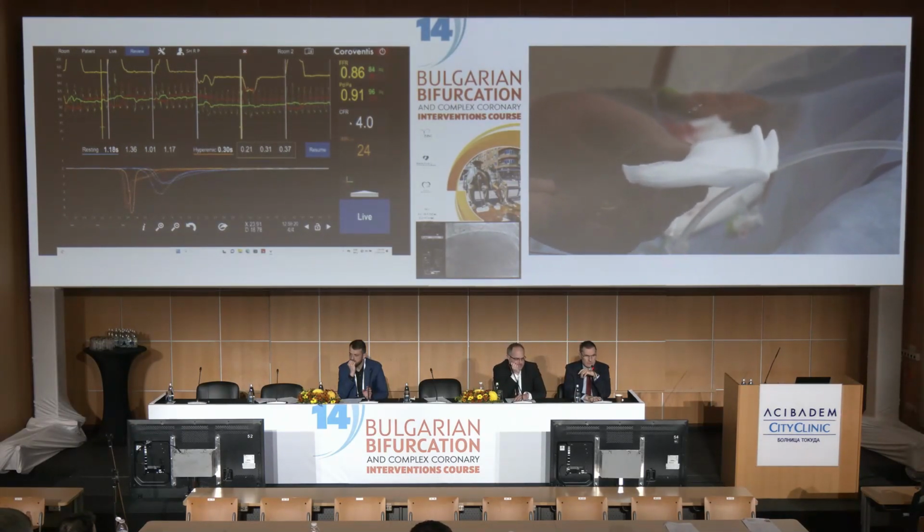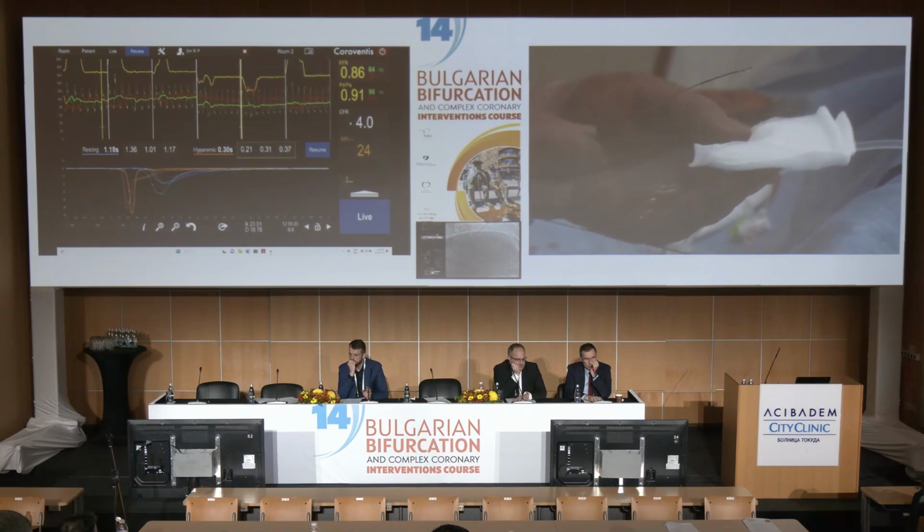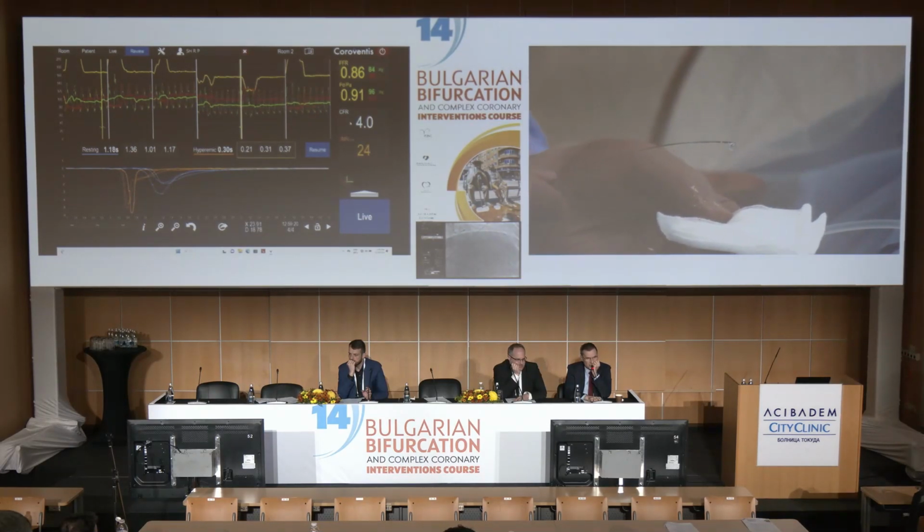So Tabo is going to activate the pump simply manually, and you see the flushing of the catheter. Do you see that on the camera? Yes. Okay, that's fine.